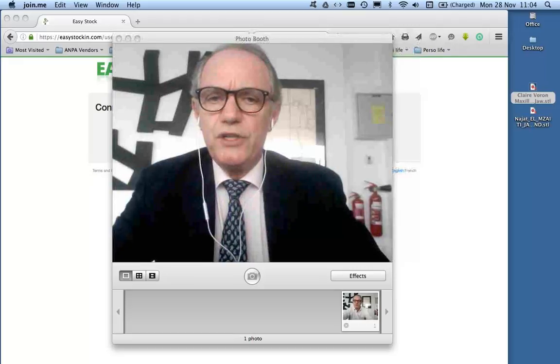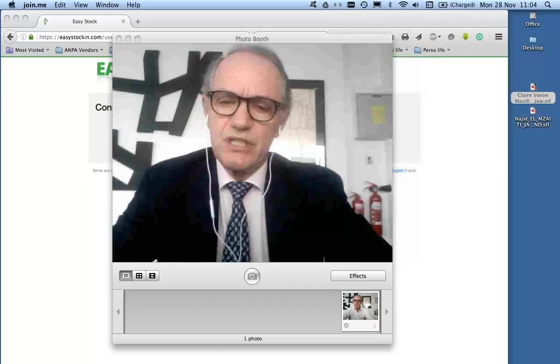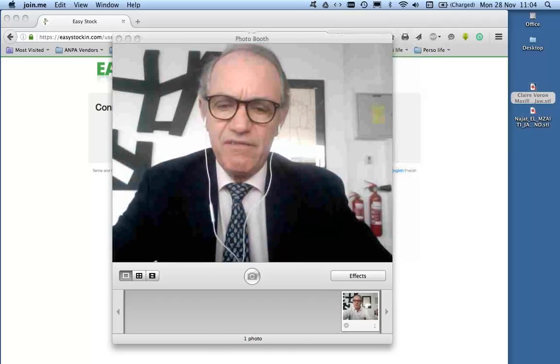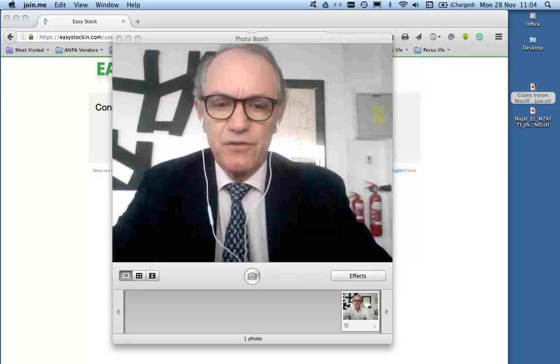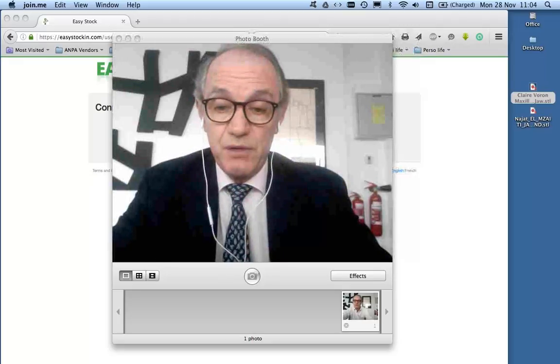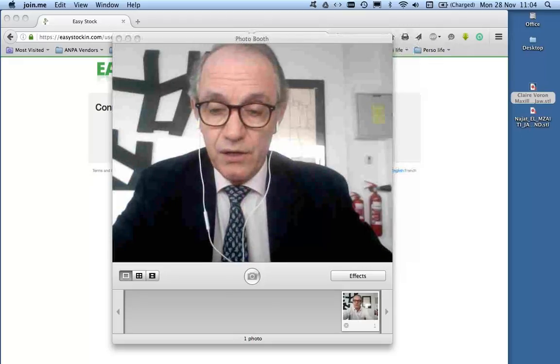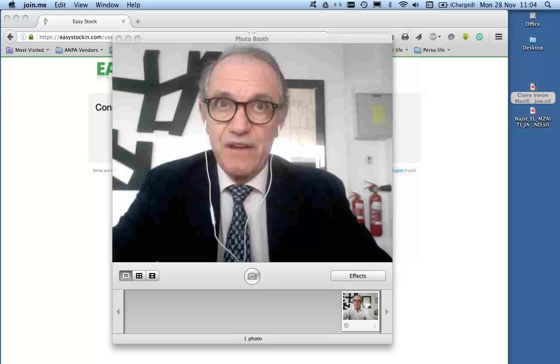Why do we need to go digital with lab orders? The first thing, and you will see that in all dental clinics, all of us, we have on our shelves some old dental models that we preciously keep to be used in the future. But all these models are full of dust. We don't even know what we have. We try to store them in a good way, but after a while, what do we do? We throw them away.